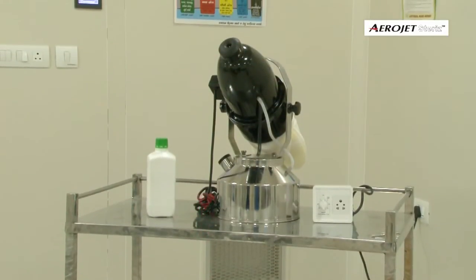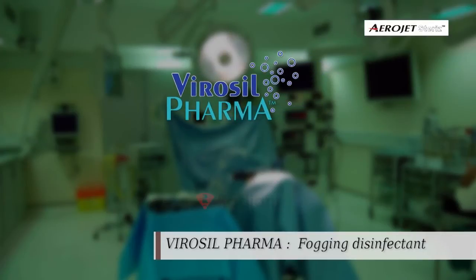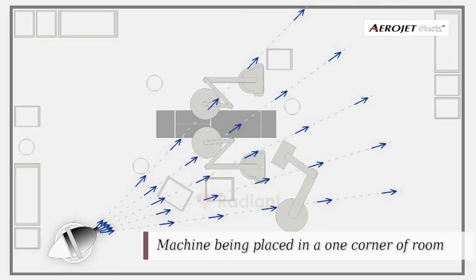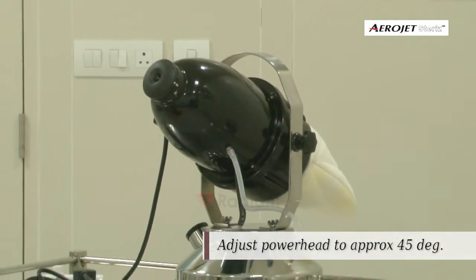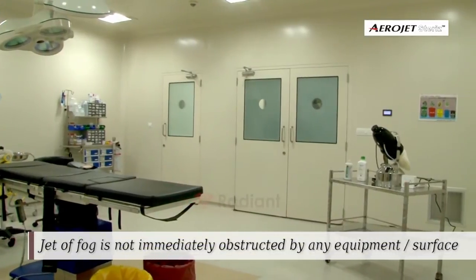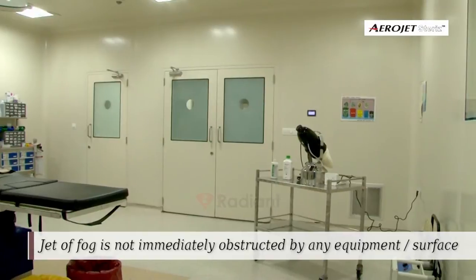Virosil Pharma is the recommended disinfectant. Angle the power head to approximately 45 degrees into the room while placing the machine. Make sure the jet of fog is not immediately obstructed by any equipment or surface.